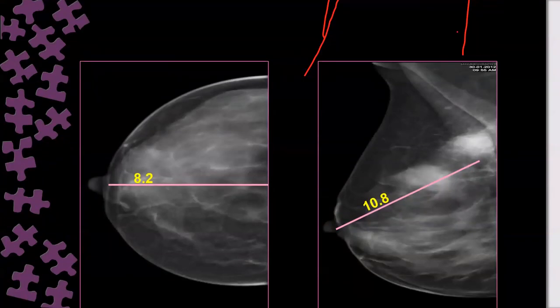What about this case? Mismatch. A big mismatch, and you can see this is cancer. This is also my patient. This is cancer, seen on MLO, but could not be appreciated. So here, you can see also one tip.